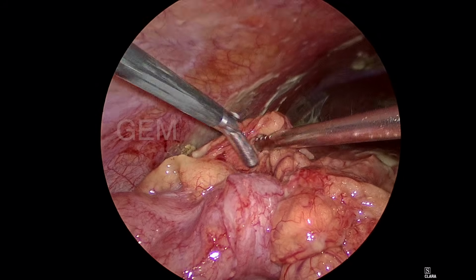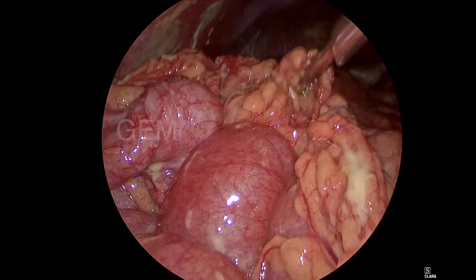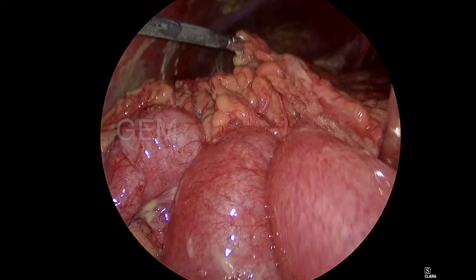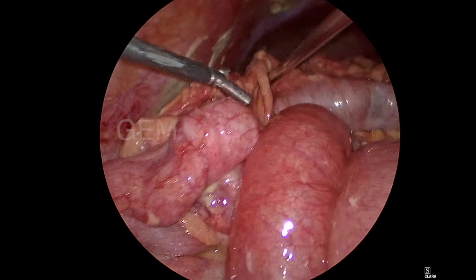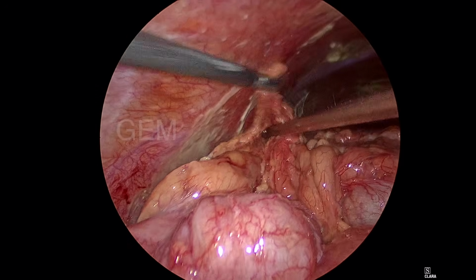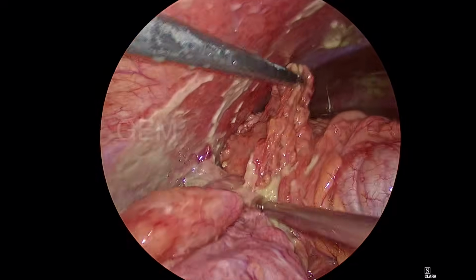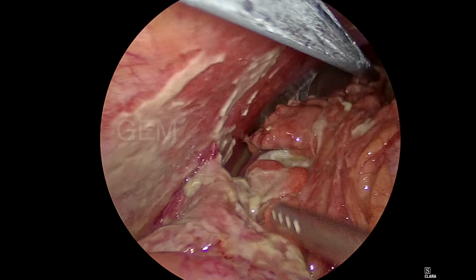That is the omental covering, and I am taking it out. That will be the first step. Basically, the omentum is called the abdominal policeman. Wherever there is infection, it will go. But in appendicitis, what I am observing is that the first thing going there is the ileum. The ileum goes and covers first. If it is a pelvic appendix, the epiploic appendages of the sigmoid colon will come and cover it. The greater omentum is the last to cover the pathology site, but during surgery we take it first.